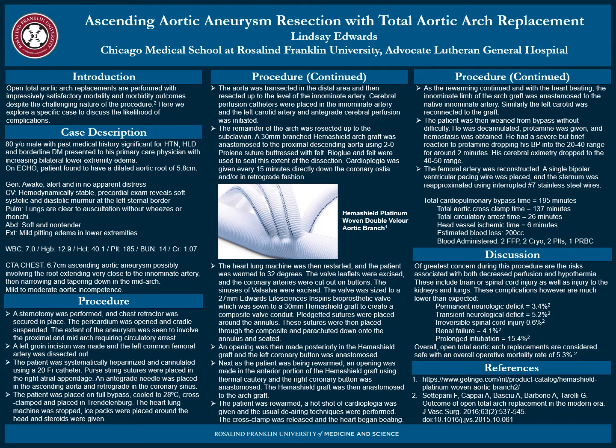Purse string sutures were placed in the right atrial appendage. An antegrade needle was placed in the ascending aorta and retrograde in the coronary sinus. The patient was placed on full bypass, cooled to 28 degrees Celsius, cross-clamped, and placed in Trendelenburg. The heart-lung machine was stopped, ice packs were placed around the head, and steroids were given.